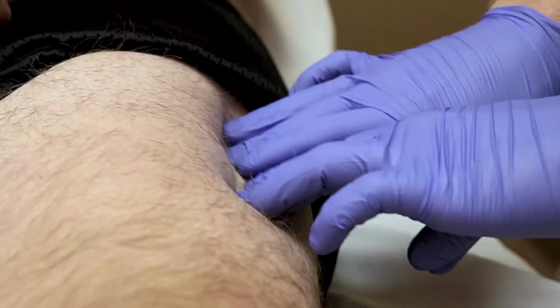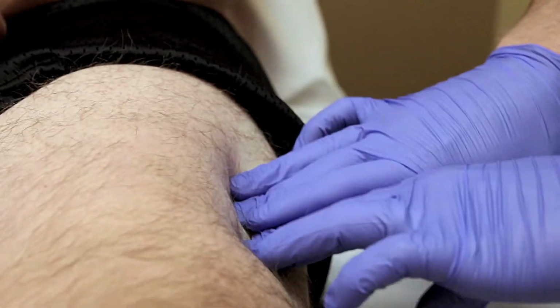Each patient will receive a thorough examination prior to the needling process. This will include a subjective examination, palpation, movement analysis to determine which muscles indeed are going to be the most effective for you. Most of my patients will report that my palpation and identifying the trigger points is more painful than the actual process of dry needling.